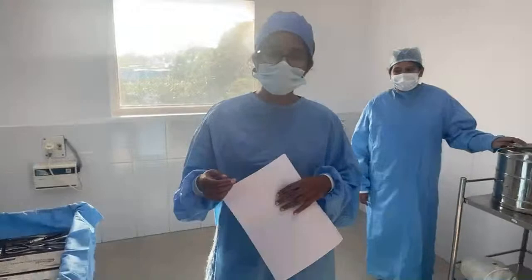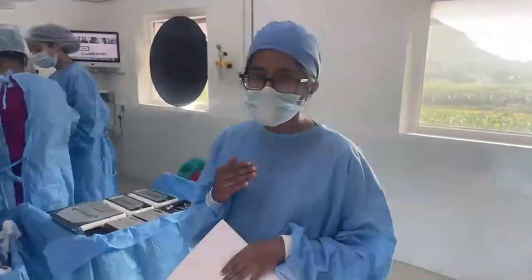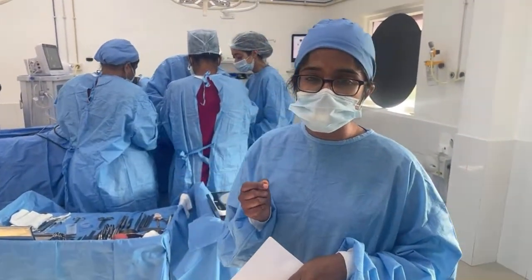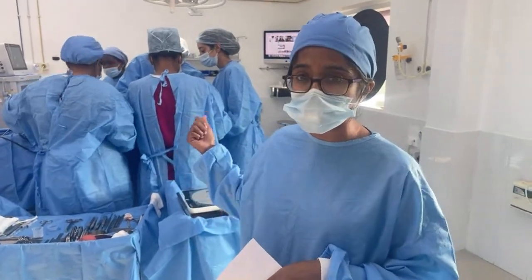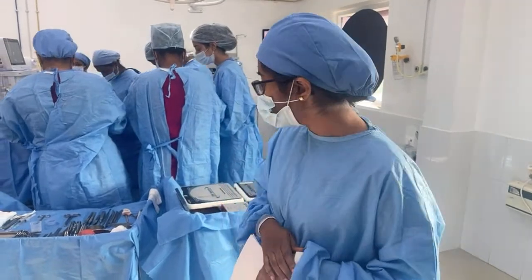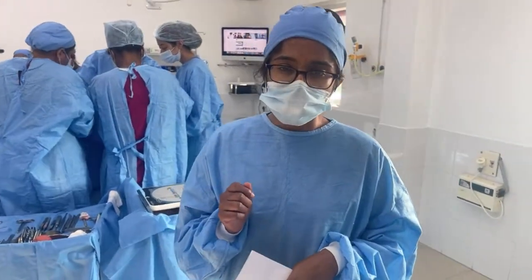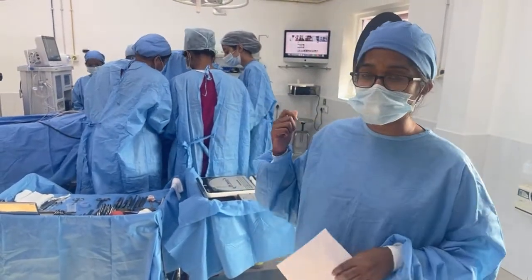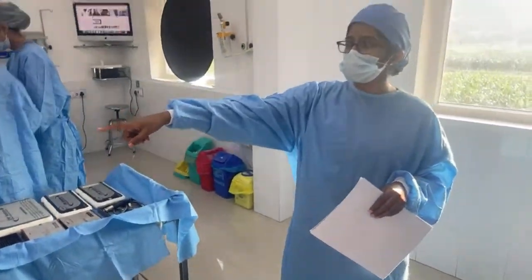It starts with an osteotomy, or a cut, which is made with the help of a surgical saw, which we will show you shortly once we reach that stage. And once we have made the cut, we are going to do some osteotomy. Right there you can hear the sound.